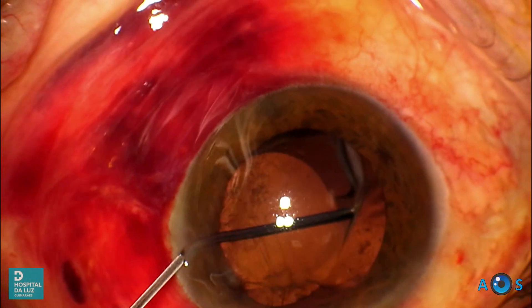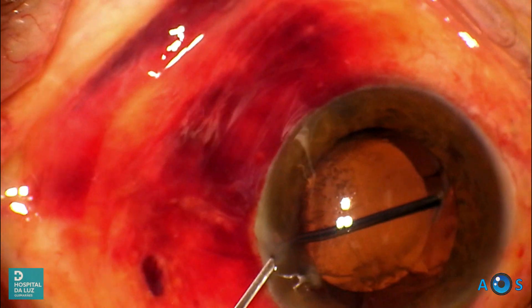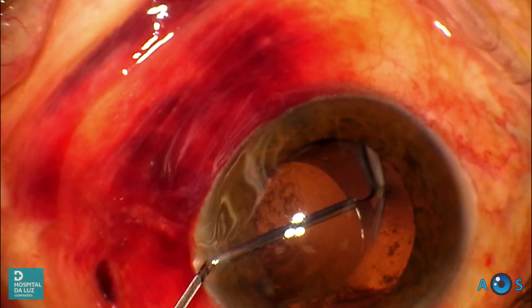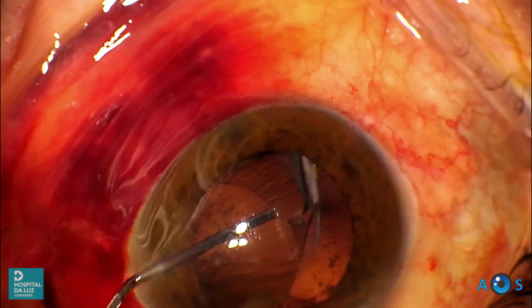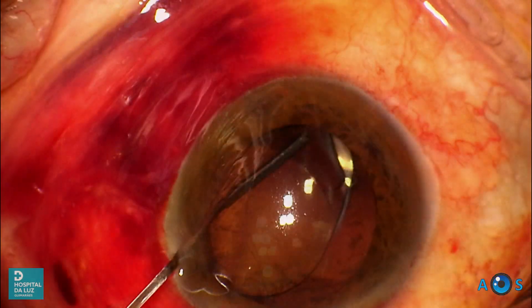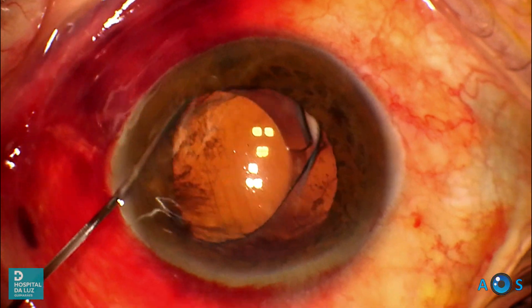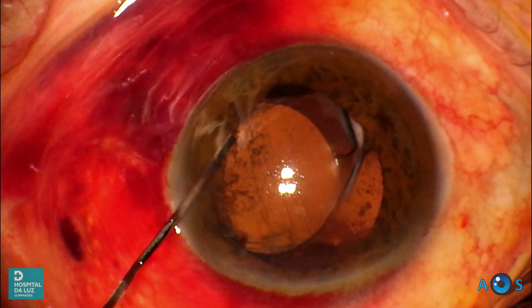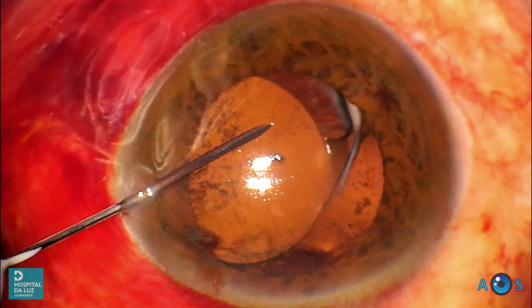The first step is to fill the anterior chamber with cohesive dispersive OVD and to assess capsular bag stability. There were no reports of complications during the original phaco, but we had to carefully explore the anterior segment. OVD is directed underneath the anterior capsule with the goal of releasing the IOL. The capsular bag seems to be intact and stable.